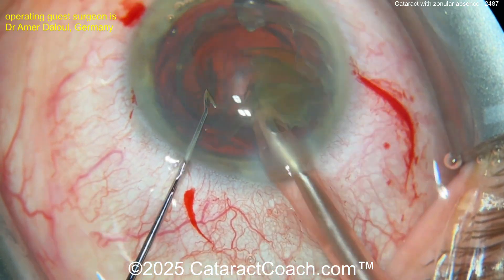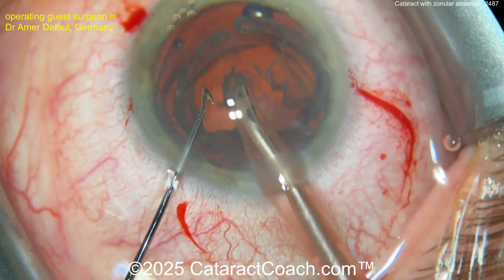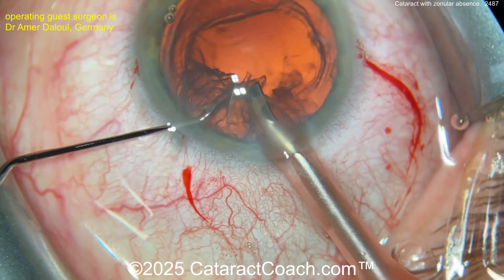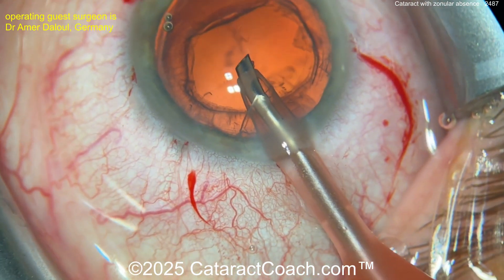Now you get that lens removed. Luckily it's not too dense and the nucleus comes up pretty easily. But be careful — remember the bag can be really floppy. You don't want to aspirate it into the phaco tip.